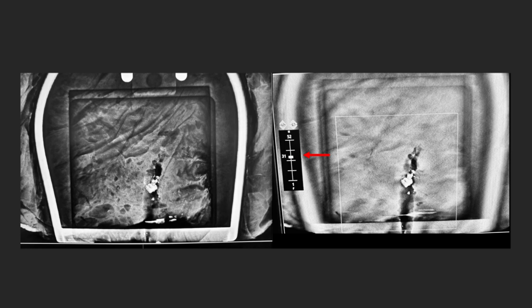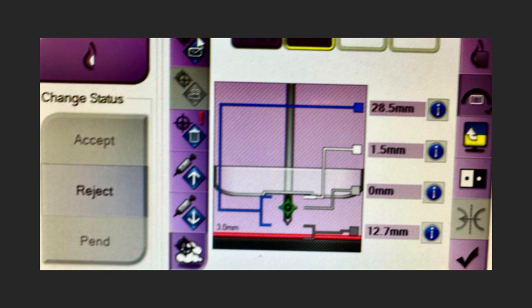So we're set up here to take our biopsy. We've taken our 2D image, and this is our 3D Tomo image for targeting. And these are just some antacid tablets I've stuffed in the middle of this piece of chicken breast. Now, when you look at the screen here, Hologic is saying, yay, everything looks good.